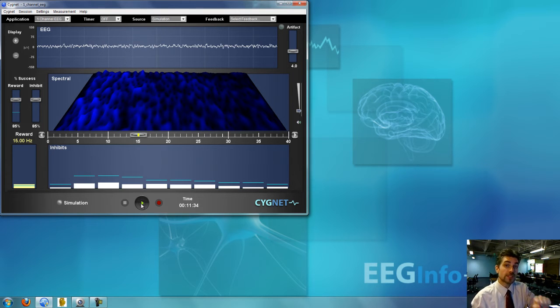If you've downloaded the latest version of Cygnet, then you already have a 20-use trial of Advanced Media Player in there, and so you can go ahead and try it out. This video will show you how to do that.